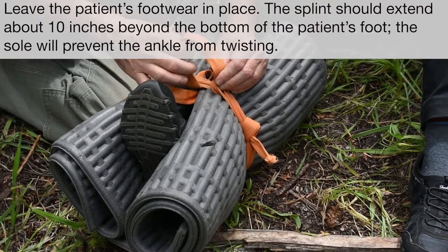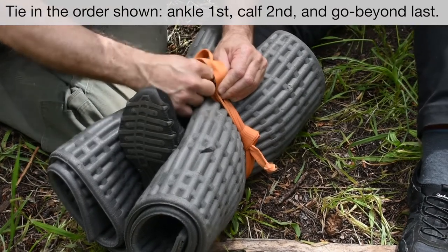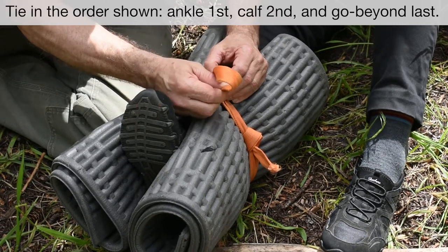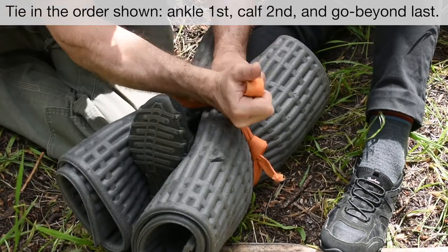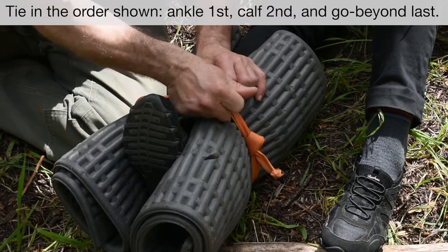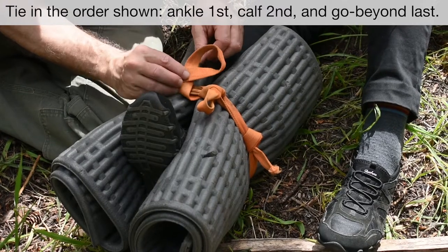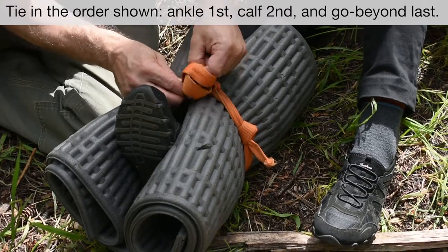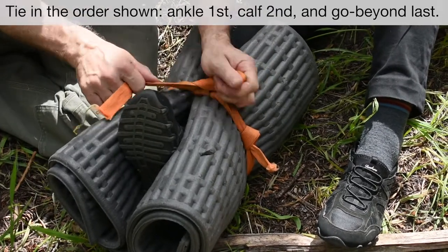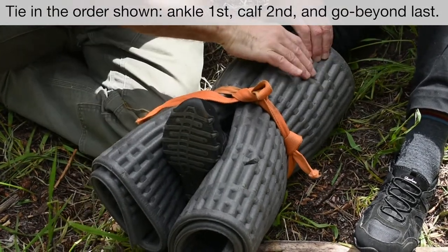I'd like to use a slip knot here: I've got this loop, pull another piece of the webbing through, and then tighten it up. Now if I pull on this end right here, it would simply untie. Here's the tricky part — I'm going to take and create this twist, like that, and flip it over top. Now if this end catches, it doesn't untie, but it's really easy to untie. Then we'll go back up onto this side and put another one right here.